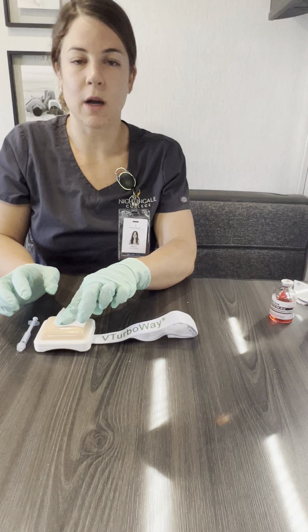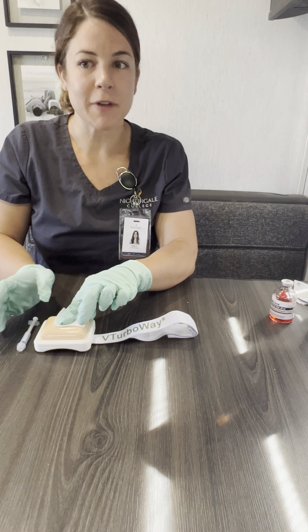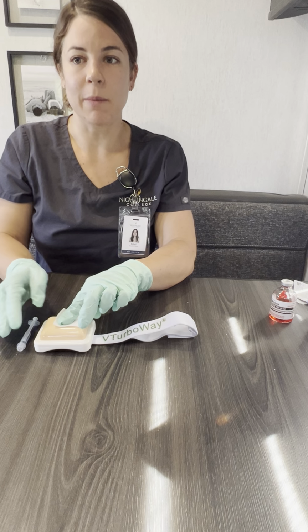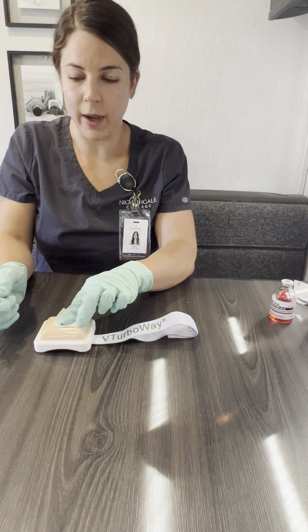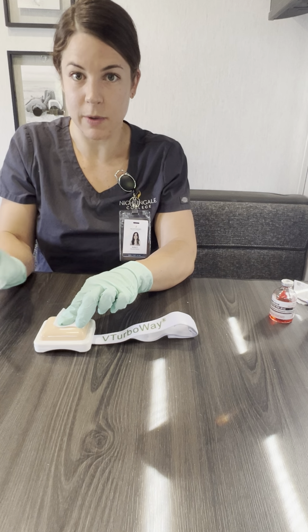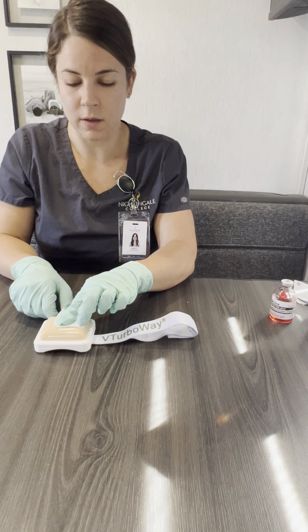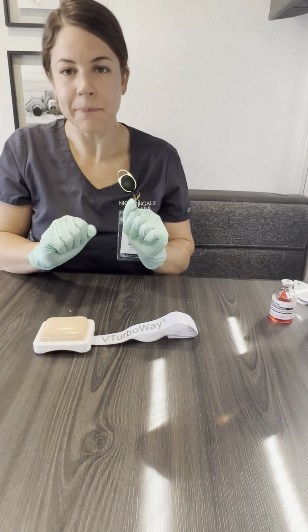We're not going to massage or rub it or anything. We're just going to put this here for comfort. If needed, you can apply a band-aid over the top here. Once you've done that, we're going to go ahead and use our safety on the needle, and we will dispose of this in the sharps container. Perfect. After that's been administered, we can throw the gauze away.